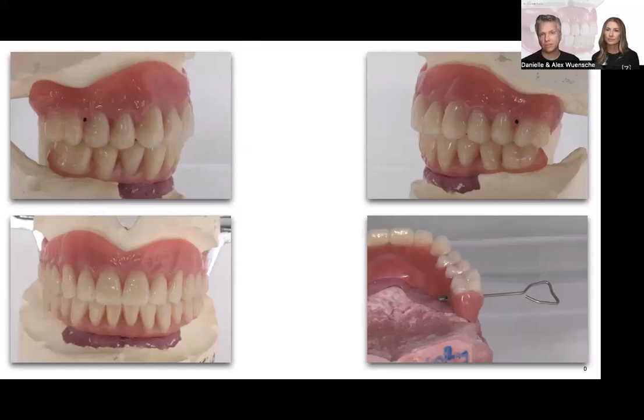If you have a patient with dexterity problems, right, or Parkinson patients, for example, they cannot do that. We have to be true to that, right? So that restoration is amazing for most patients, literally. There are exceptions for patients. Maybe your patients cannot deal with that little tool, which is very thin. It's almost like a paper clip, but finding that hole, right? It's not as easy for these patients. It's easy, but for some patients, it's going to be a little bit challenging sometimes to find that hole.